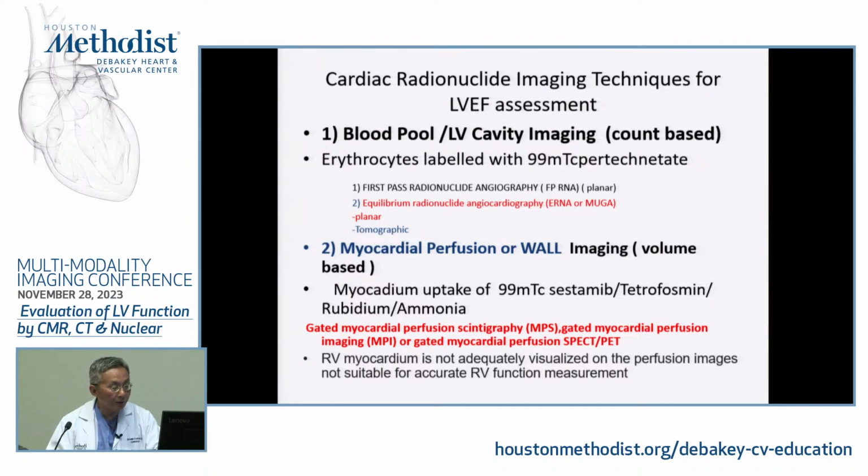It's a planar study, but you can do tomography. We probably did fewer than 5 or 10 in the last year. It's rarely done anymore, but I think there's some special use in certain clinical scenarios.